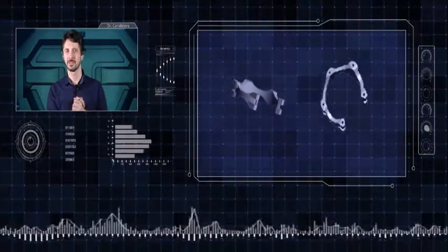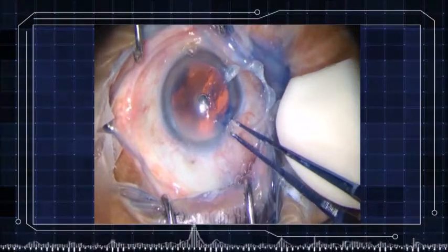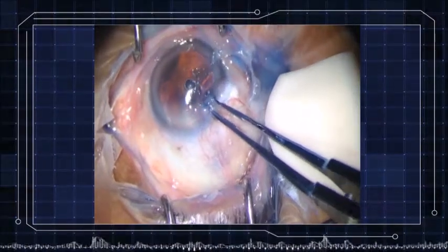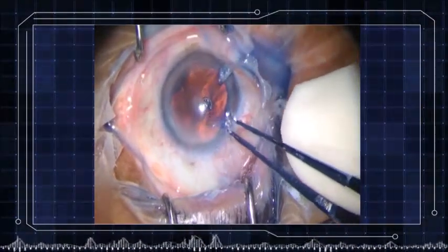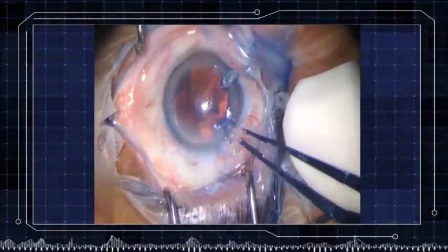I don't like this one, Jarvis. You are right, Dr. Kanabrava. You can see from this first model in the video simulation how it is not possible to insert the ring in the eye.